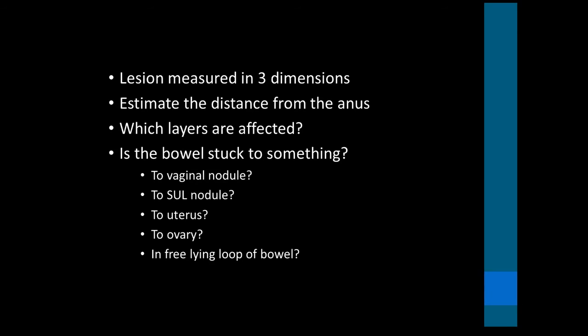It's not extremely accurate, but it gives the surgeons an idea of approximately how far away it is from the anus, as that may influence the surgical technique they use and whether they remove it at all, because the closer it is to the anus, the more difficult it becomes to remove, and particularly if it's closer than 7 centimeters, then it becomes very difficult to remove.